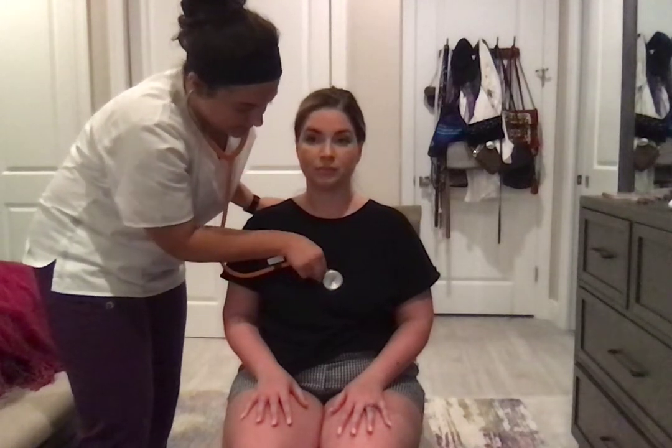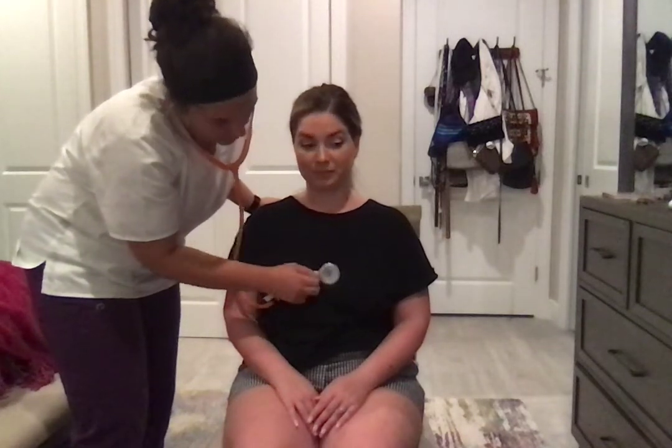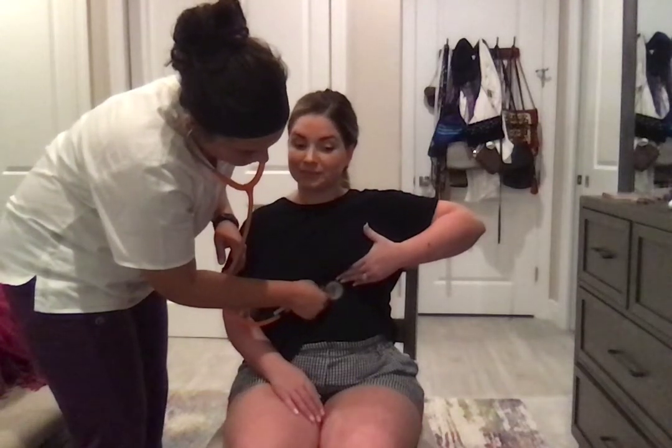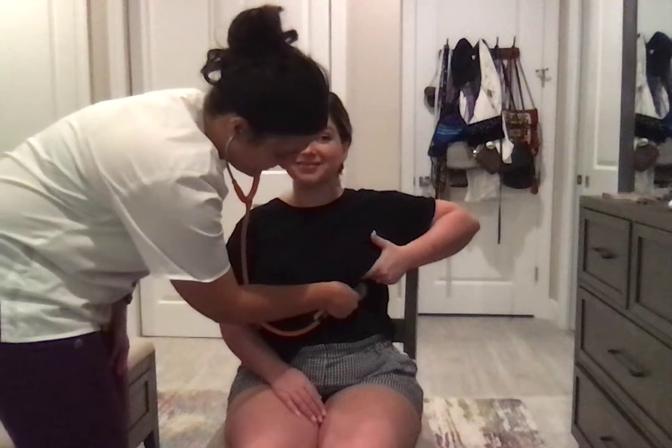Erb's point. Sorry. Okay. Let me know if you're uncomfortable. And then we have the mitral valve. And then we have our apical pulse, excuse me.